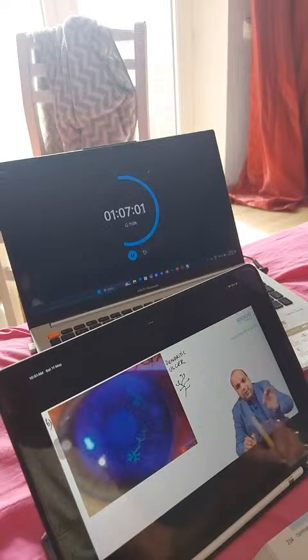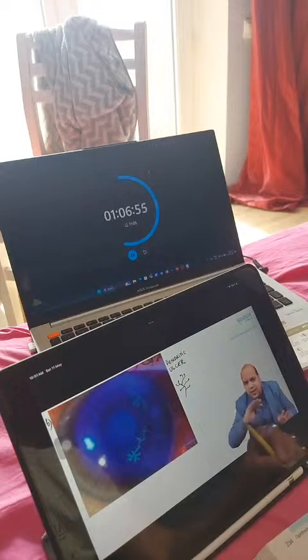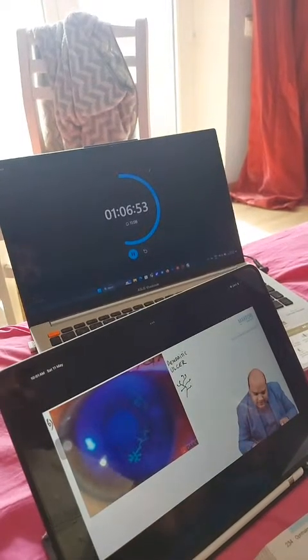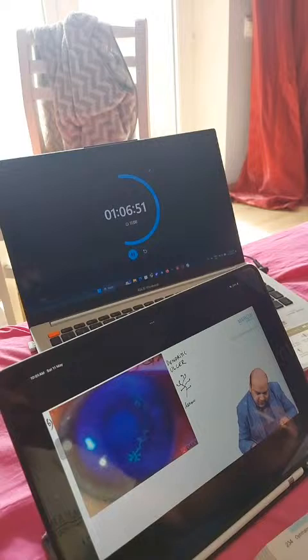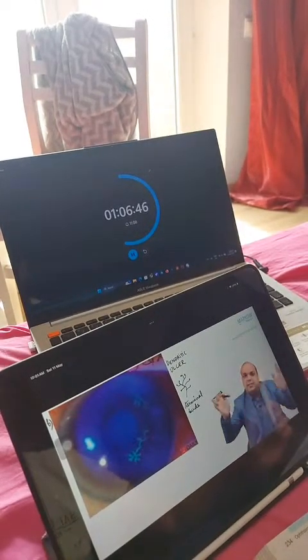At the end of each branch, you will be able to see small elevations, very small elevations. You cannot make it out in this photograph. It has already been stained with fluorescent dye, so the dye is filling everything. But at the end, we see terminal buds. These are the locations where the virus is being carried, and that is why the ulcer is getting progressed.